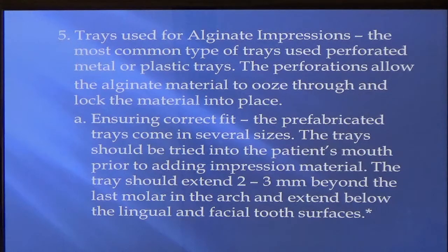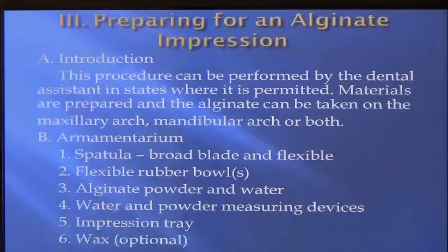And you should be able to slide it in and stretch their lips so that it fits. If it's too tight, then the alginate material there is too thin, it's going to rip on you. You're not going to get a good impression. So make sure it's big enough to go behind the second or the last molar, and again, move it left and right so that it wiggles a little bit. Have 2 millimeters on each side, because you need material there for bulk. If not, you're not going to get a good impression.